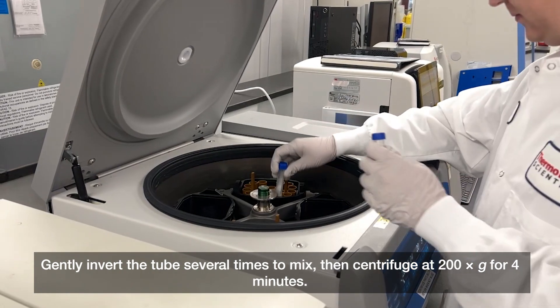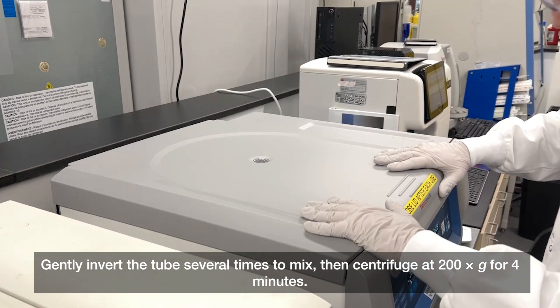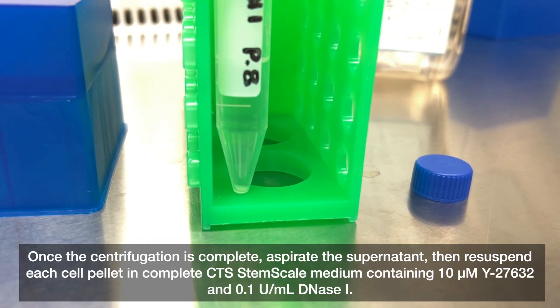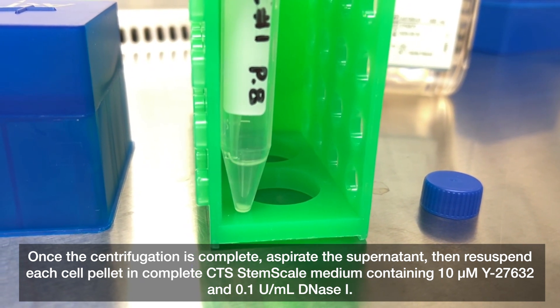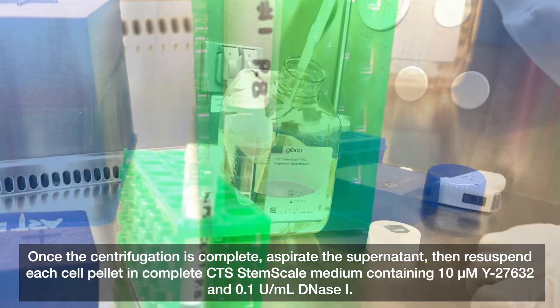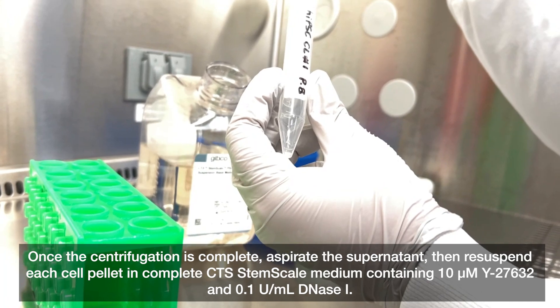Gently invert the tube several times to mix, then centrifuge at 200 g for four minutes. Once centrifugation is complete, aspirate the supernatant, then re-suspend each cell pellet in complete CTS StemScale medium containing 10 micromolar Y27632 and 0.1 units per milliliter DNase 1.